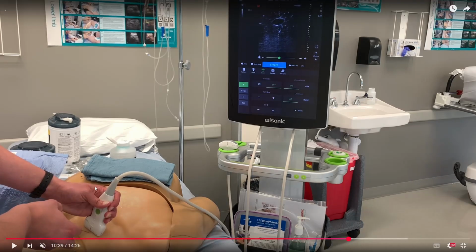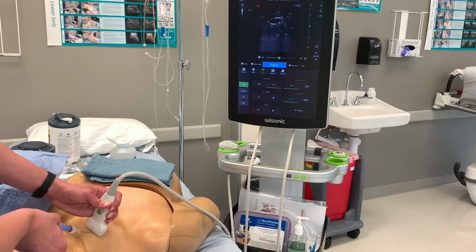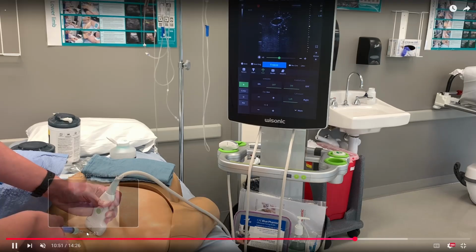And one thing I want you to pay attention to is that when my hand jiggles down here, up here jiggles too. That's how I find the path of the needle. Negative pressure being pulled. Jiggle, jiggle, jiggle, trying to find the tip of the needle. Once I find it and I'm confident, I'd continue to insert, and then bam, right there.